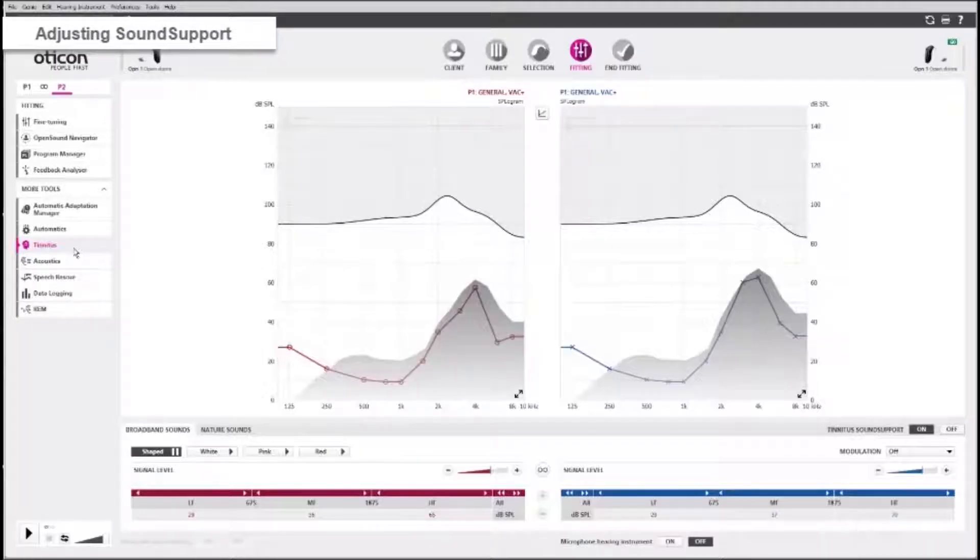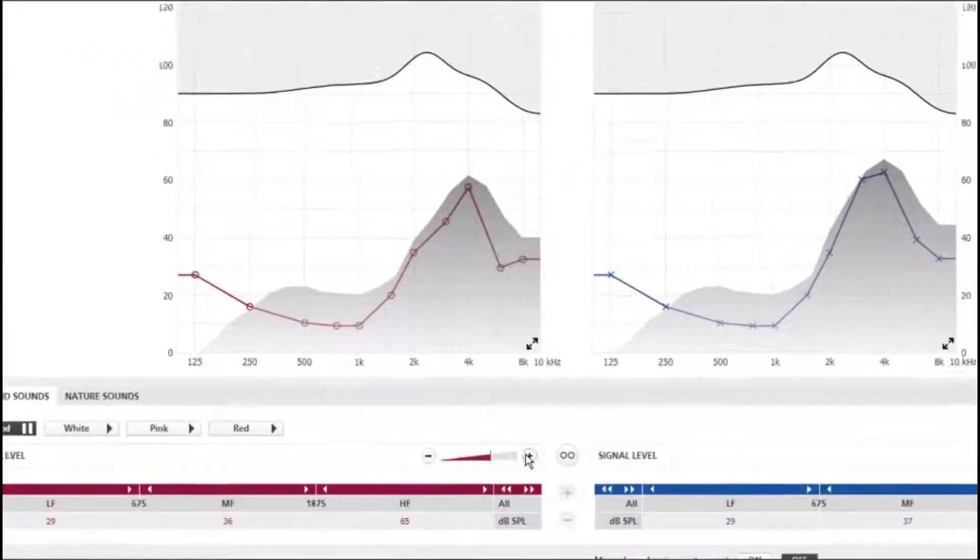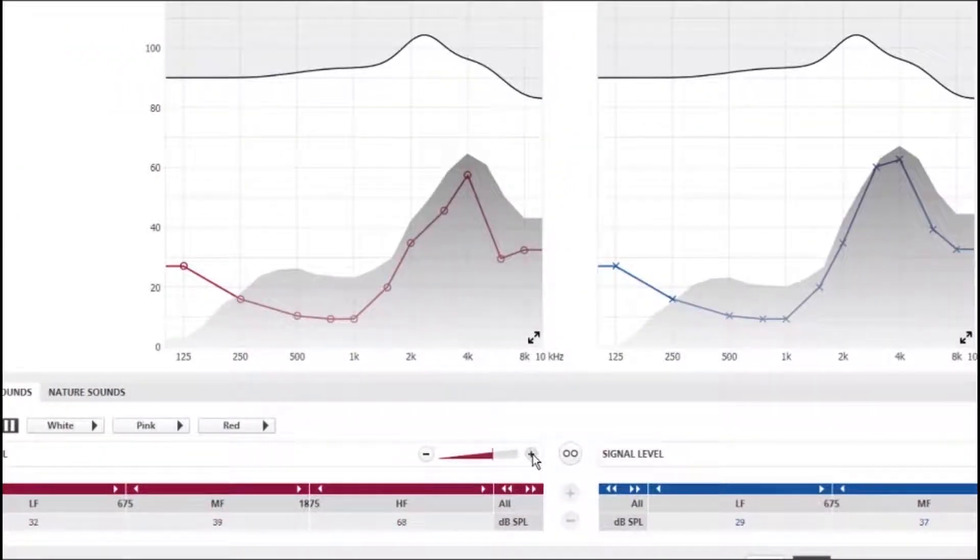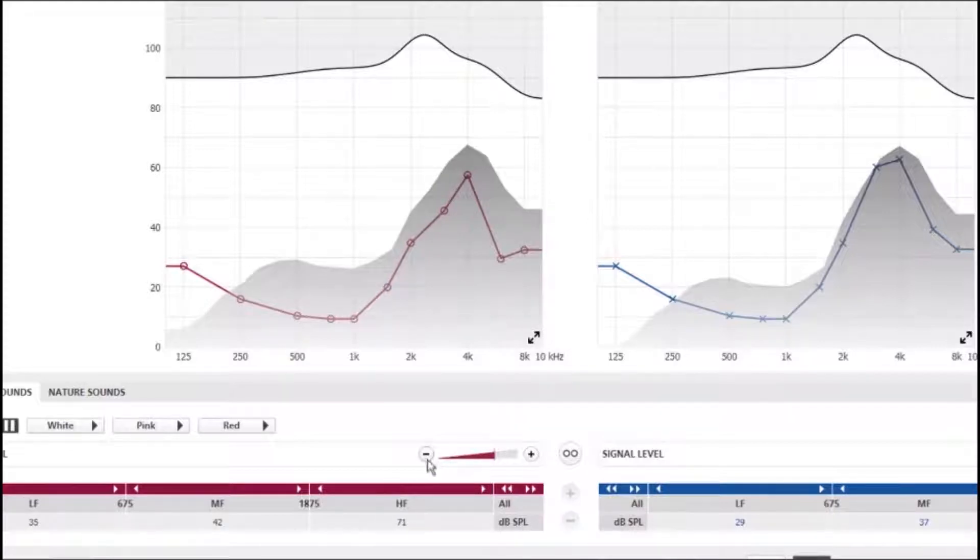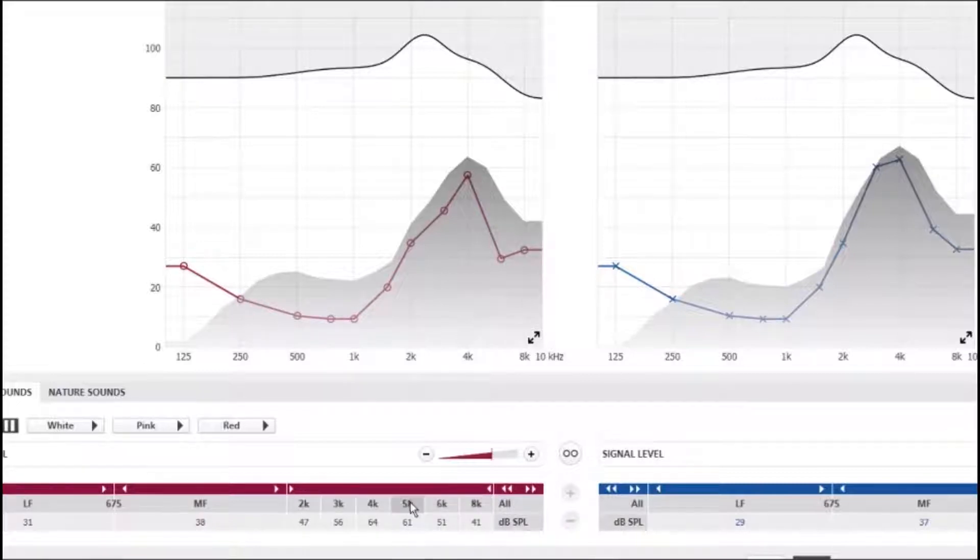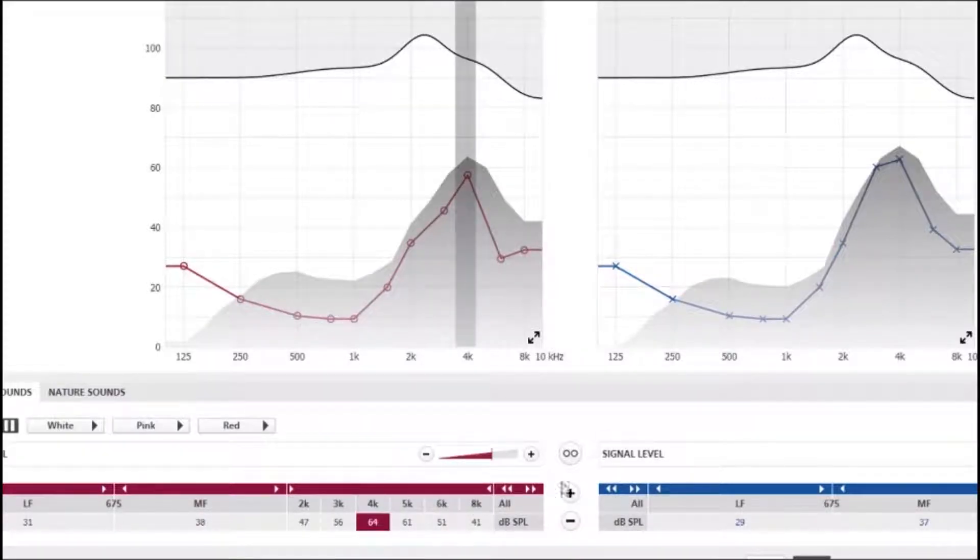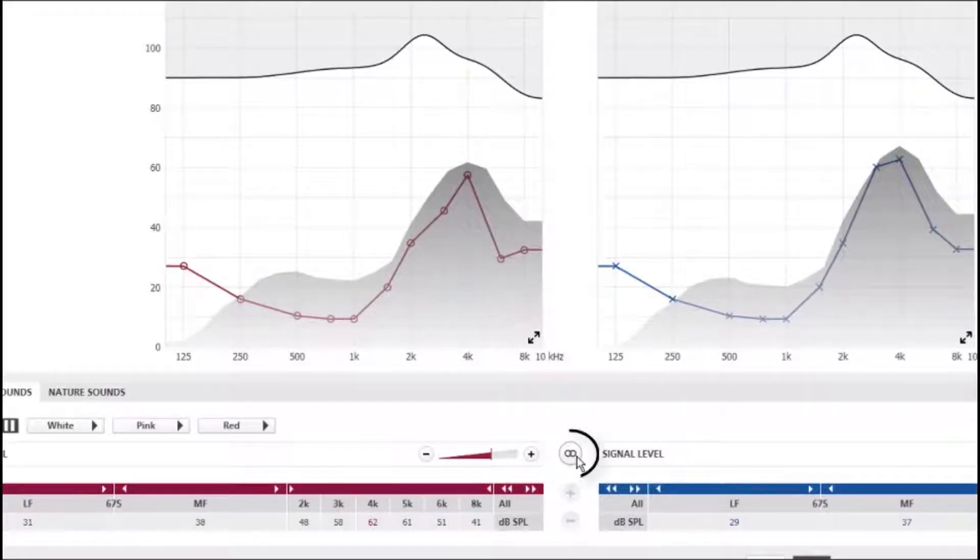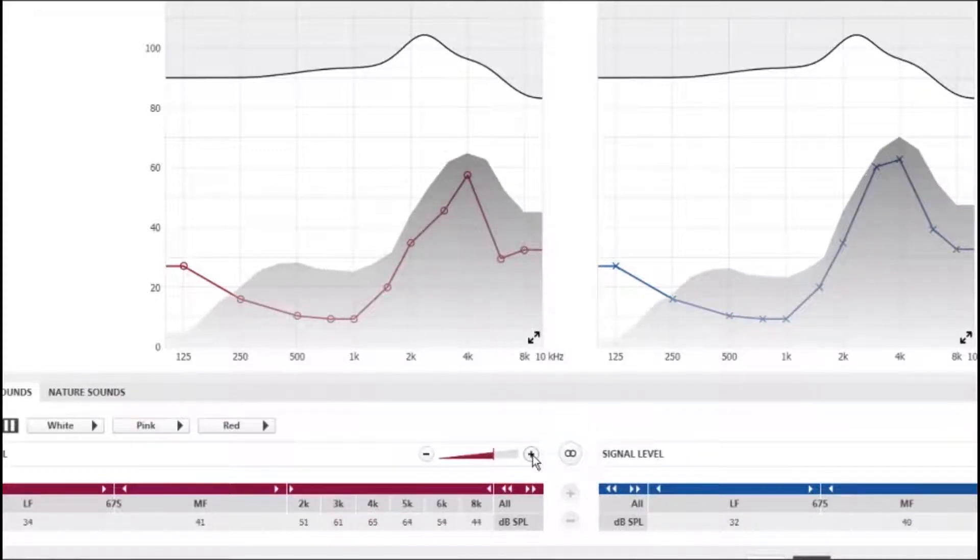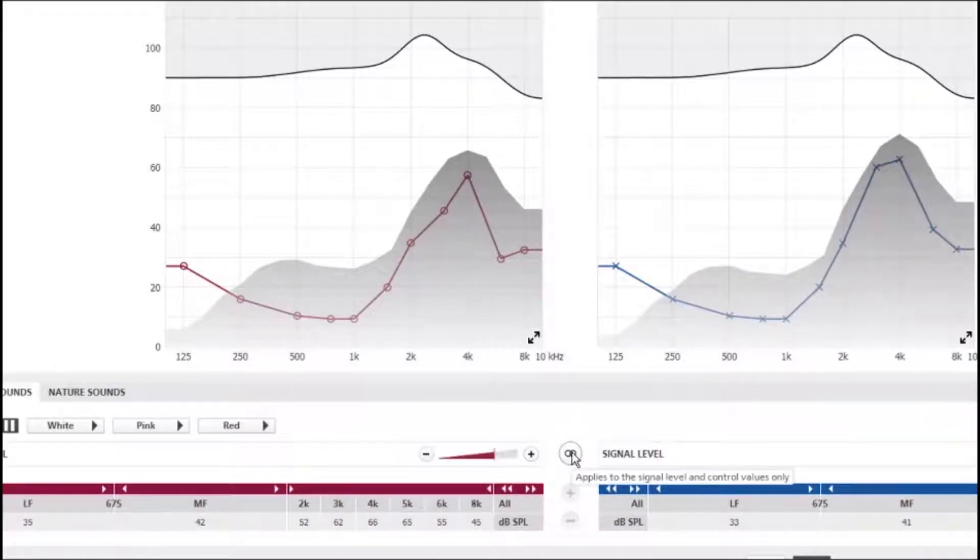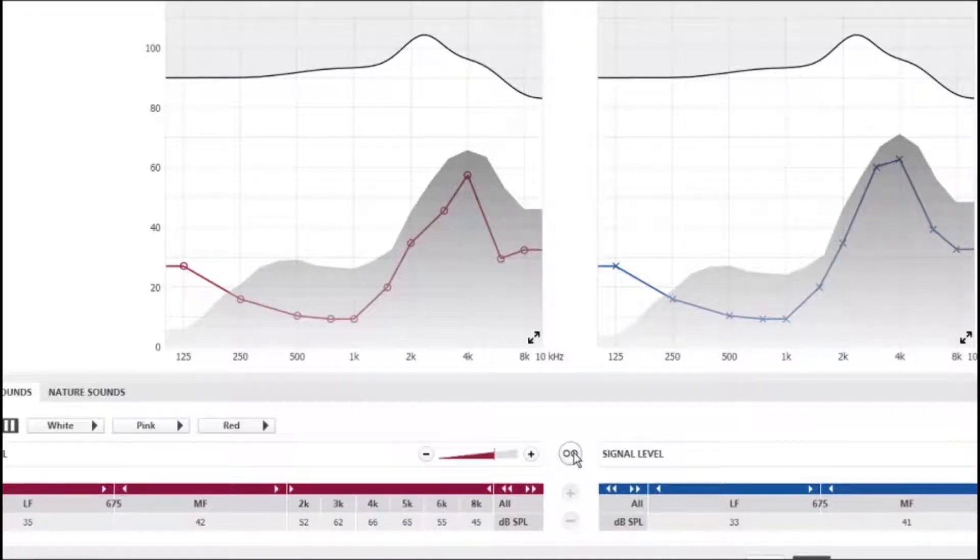You can adjust Tinnitus Sound Support according to your treatment goals. You can adjust the general signal level or shape the frequency for individual bands. You can make changes simultaneously to both sides by using the link button, or choose to make adjustments to each side independently of each other.